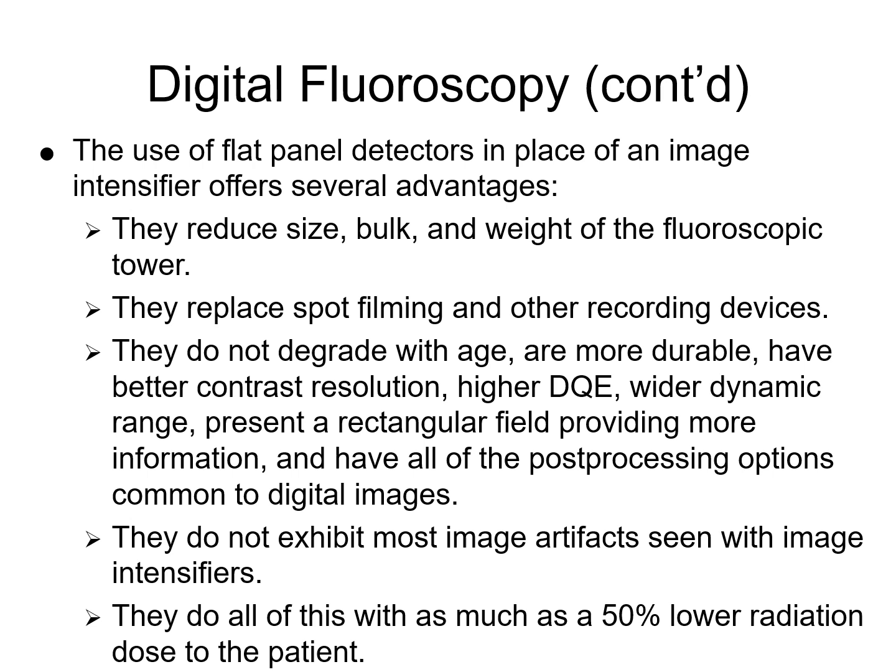All right, so the first advantage of upgrading from image intensified with CCD coupling to pure flat panel DF is the flat panel tower is smaller. It takes up less room, and it doesn't weigh as much as an image intensifier. So it's not as bulky, it's easier to fit into a room. You could potentially fit into a little bit smaller room. You just still got to have room for the table, but it doesn't take up as much space as an image intensified fluoroscopy unit does. It's also easier to steer around because it's not as heavy as the image intensifier is.